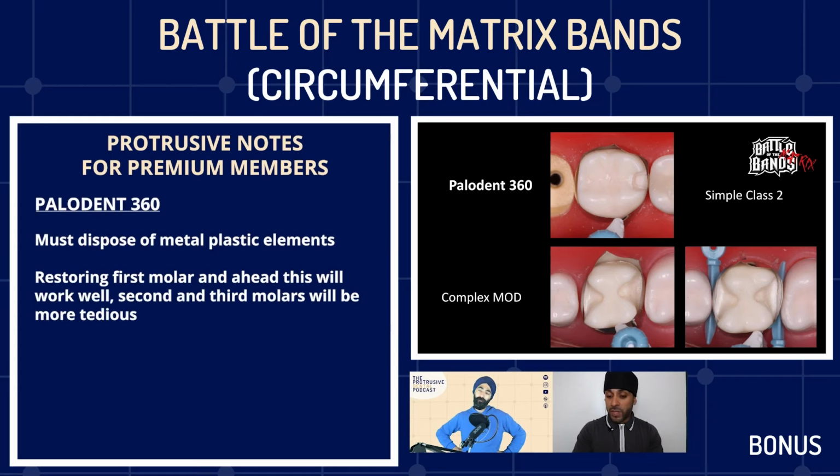So to summarize, I think if you're doing anything like 6, 5, 4, forward, it's pretty good. But 7s and 8s, maybe it gets a bit tedious. Yeah, the ergonomics of reaching makes sense. Exactly, because everything looks great on the videos, right?